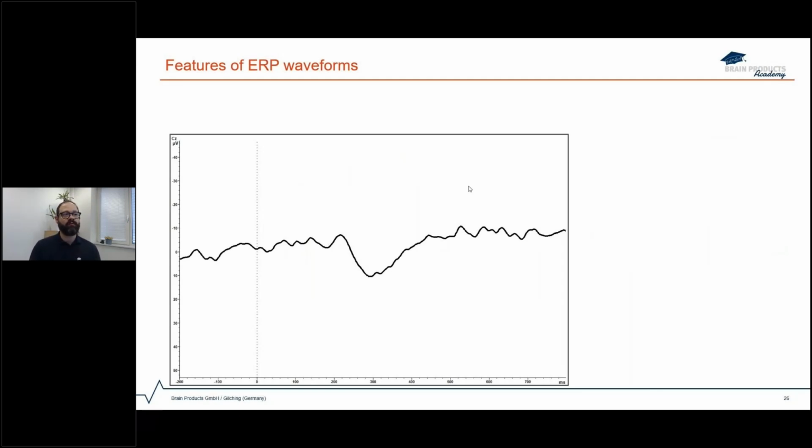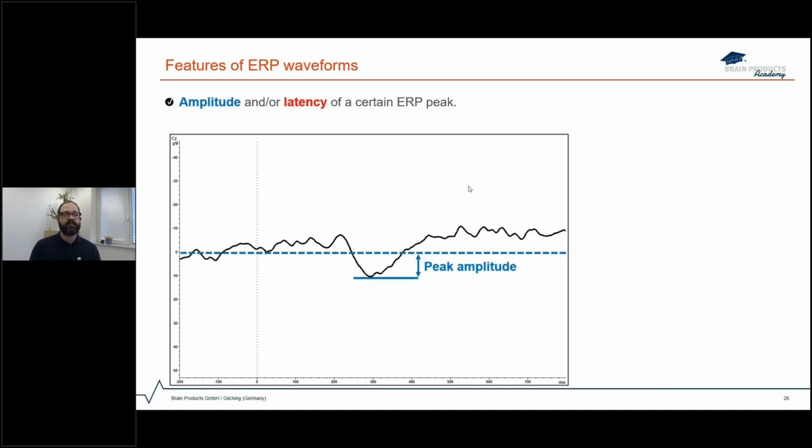And just a bit more on the practical side, what can we export and how? If we're looking at peaks, for instance, the visually evoked potential that we're looking at is a rather peaky component that is short. There it makes sense to look at peaks, and therefore we can look at the amplitude of the peak and the latency of the peak. So we can look at one of them or both. And if we have maybe a little bit broader peaks, later potentials tend to be longer and larger, but there are also some potentials that are rather slower drifts.